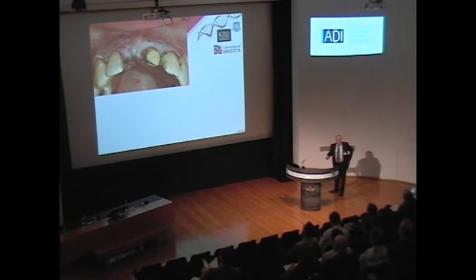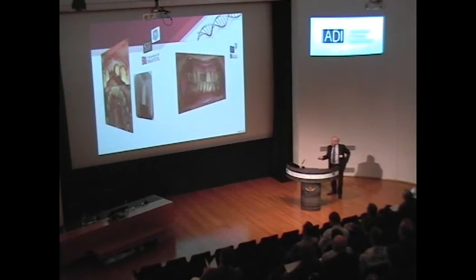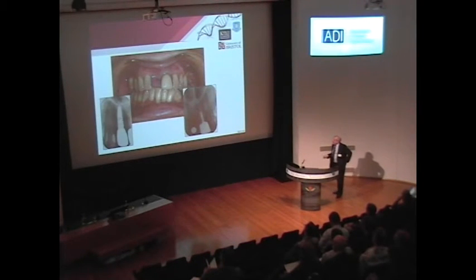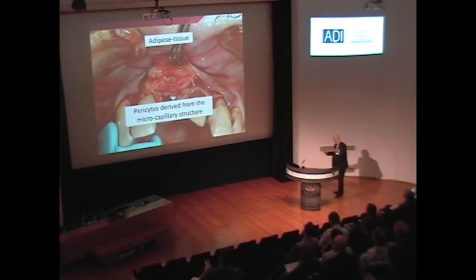Again, suture technique, no compression is going to take place. I'll put this in because a few other implants we've done at the same time. And that's where we started from. That is our site. That is the implant a few months later. That's actually 3 months post-fit. And what you're going to have in mind, with that volume enhancing, there are a couple of special things that are going on, which are not really publicized very much in dentistry today.